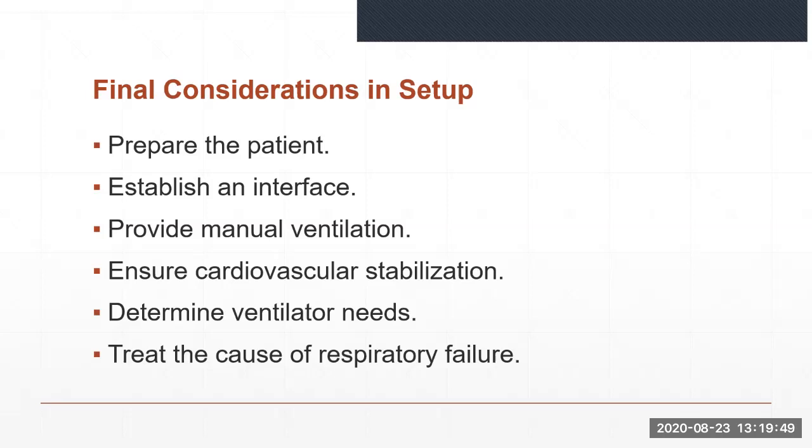For non-invasive ventilation, a face or nasal mask is snugly fitted. During invasive ventilation, the three most commonly used artificial airways are orotracheal, nasotracheal, and tracheostomy tubes. Orotracheal tubes are used for emergencies and are generally kept in place for several days. Nasotracheal tubes provide better patient comfort but may require more insertion time. Nasotracheal tubes usually have smaller diameters than orotracheal tubes and are associated with increased incidence of sinus infection.